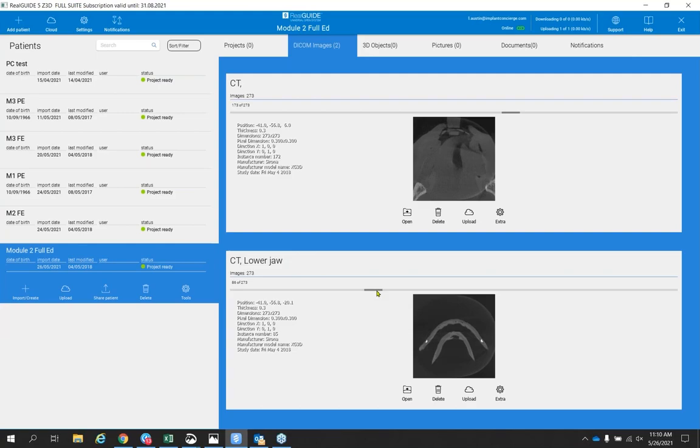I set lower dentures on the base of the denture. If it's a maxillary denture, I'll just set that teeth side down so it's upright. Just like the patient's wearing a denture, set the denture on those radiolucent pedestals, whether it's a foam block, what have you. Most machines have something that you can use for that. And then you can scan it.